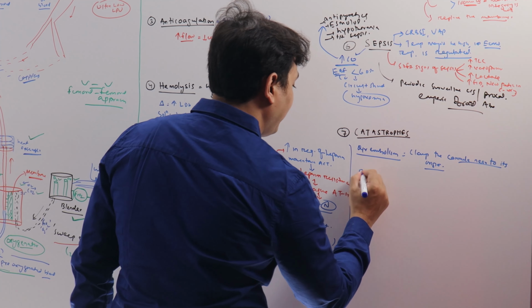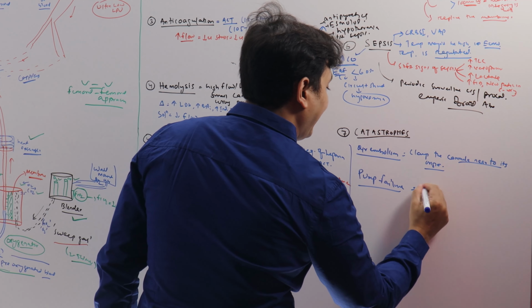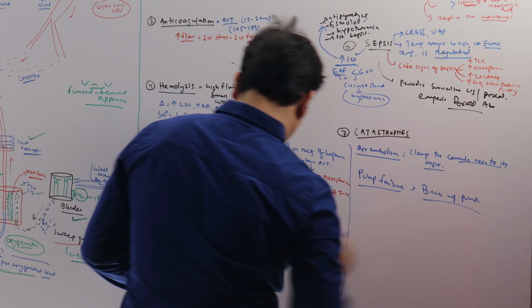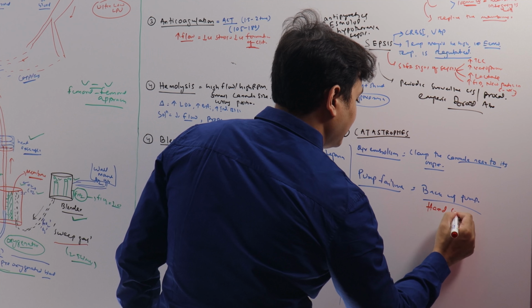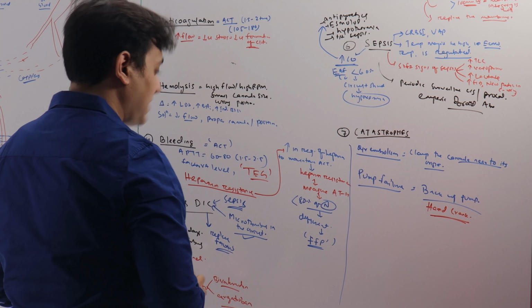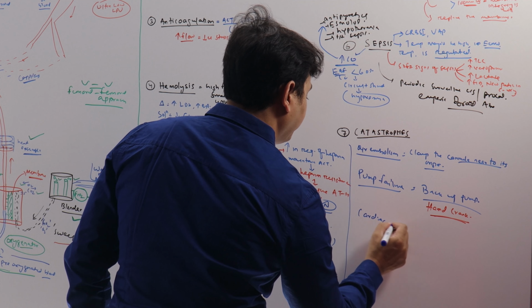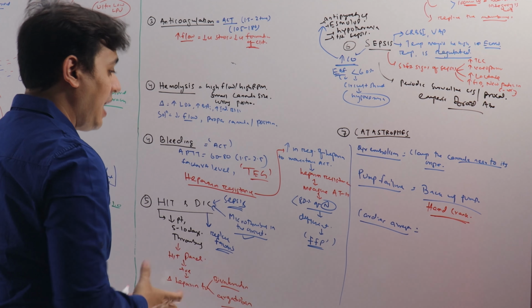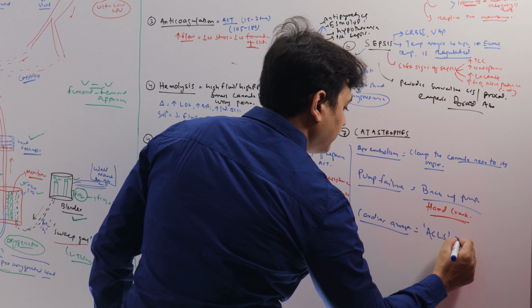So you can have a pump failure. So always keep a backup pump ready, right? Otherwise you can use the hand crank that is given along with it, right, to manually pump for some time. Third, if there is cardiac arrest, what to do? Since it is a veno-venous ECMO, we are not providing any support to the heart, so all the ACLS algorithm will apply here.